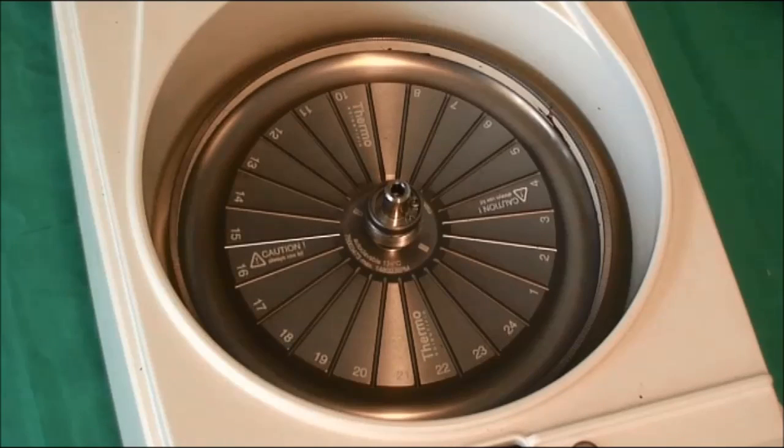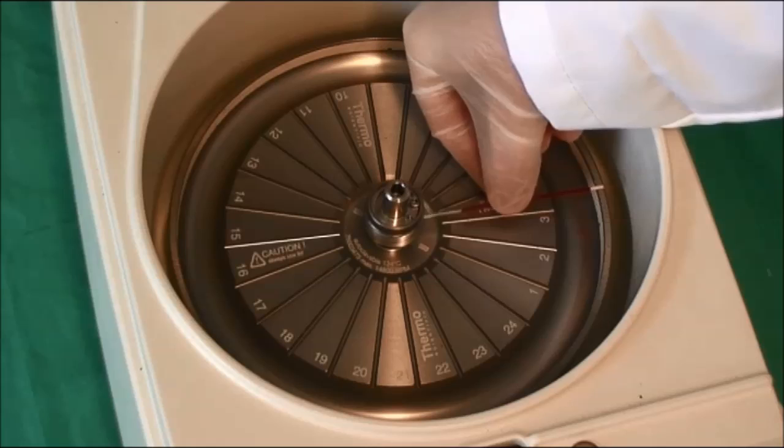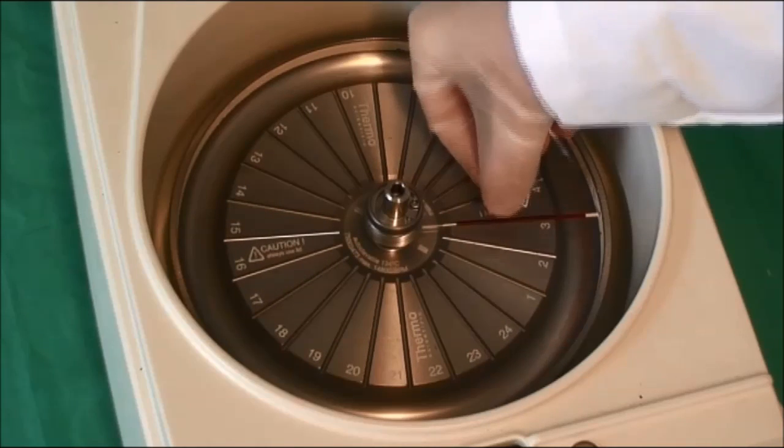To place the sample into a micro-hematocrit centrifuge, the plugged capillary tube should be inserted into one of the provided grooves, ensuring the plugged end is facing out from the centre of the machine.